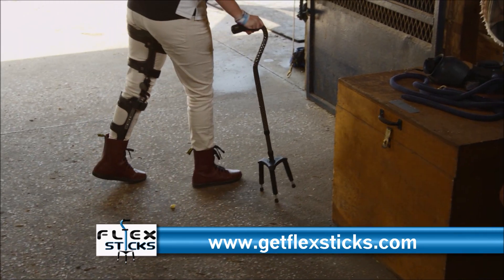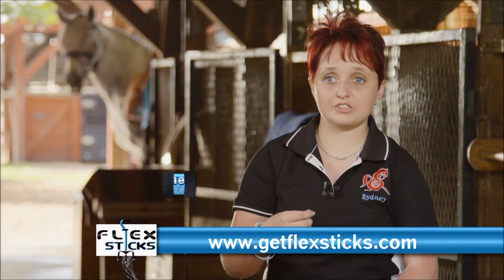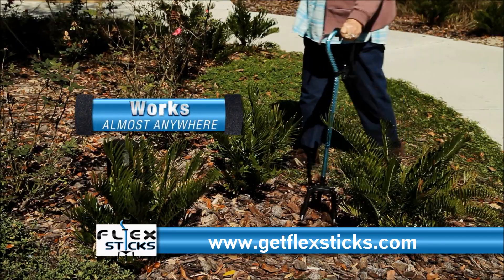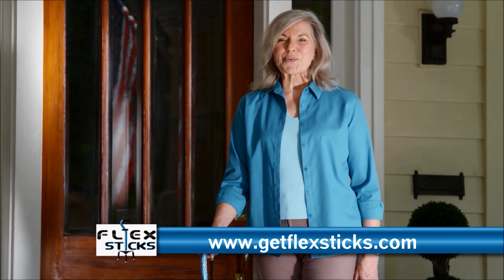My FlexStick was really awesome because it stands on its own, and I can actually use it on different types of terrain and always have my stability. FlexSticks work on all types of surfaces, including concrete, carpet, grass, and even rocks.